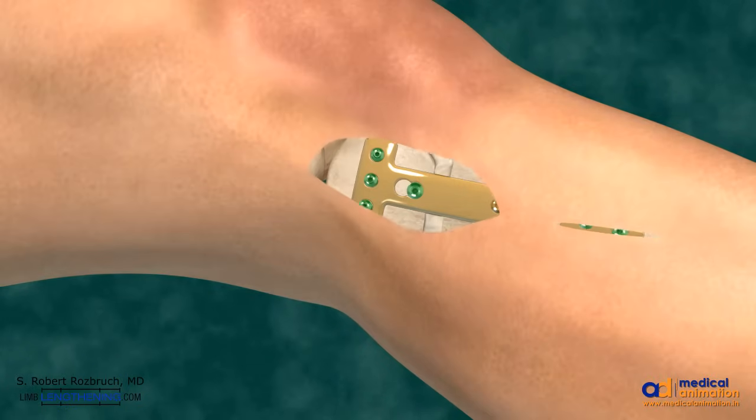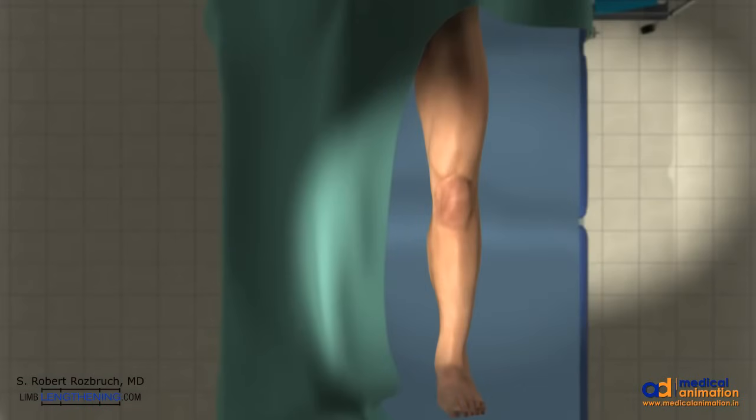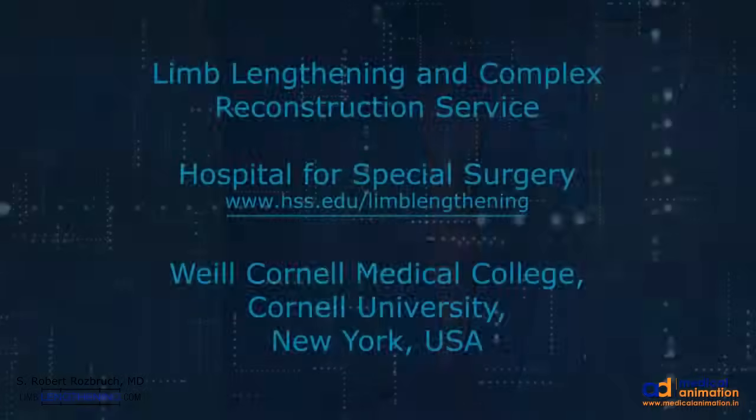And the incisions are simply closed. Thank you for your attention. I hope that this has been an informative review of high tibial osteotomy opening wedge to correct bow leg.